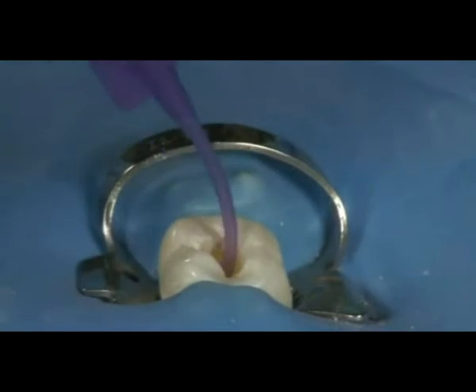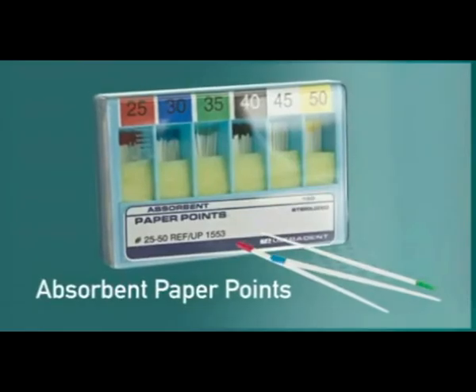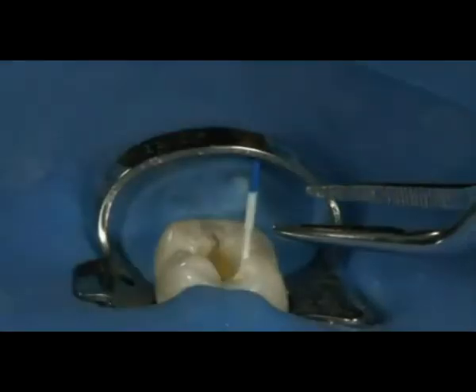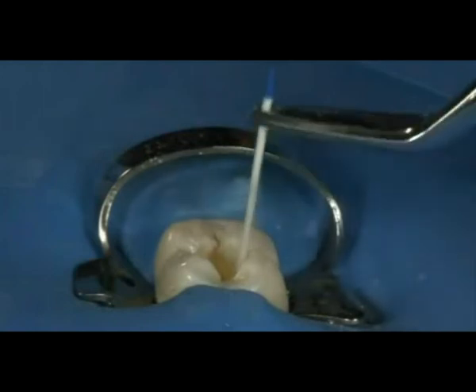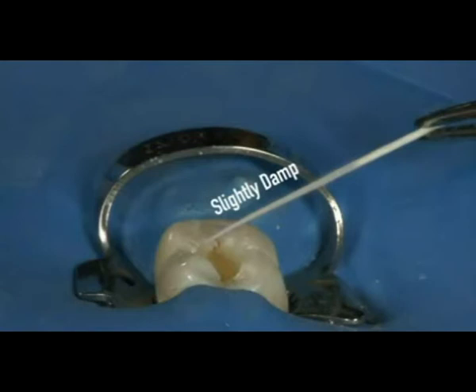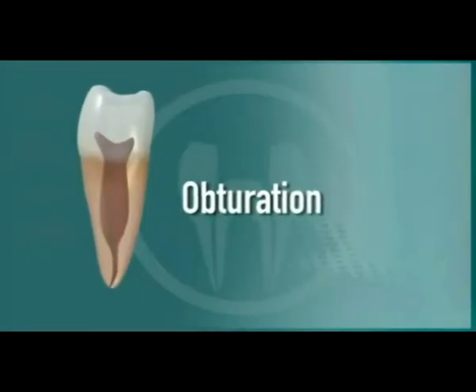Evacuate one last time with the lure vacuum adapter to remove the Consepsis from the canal, and blot out the canals using 1-2 paper points. Because we will be sealing the canal with EndoRes, it is not necessary to desiccate the canal. Leaving the canal slightly damp will provide the best environment for EndoRes to penetrate into the tubules. We are now ready to move on to the obturation portion of the procedure.